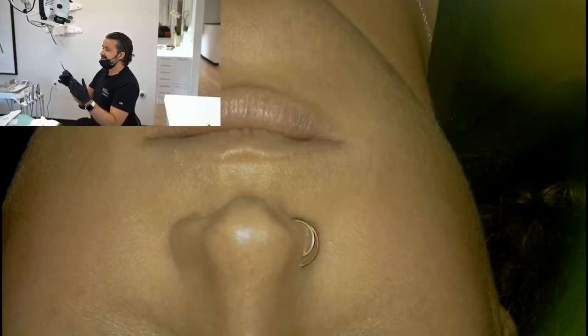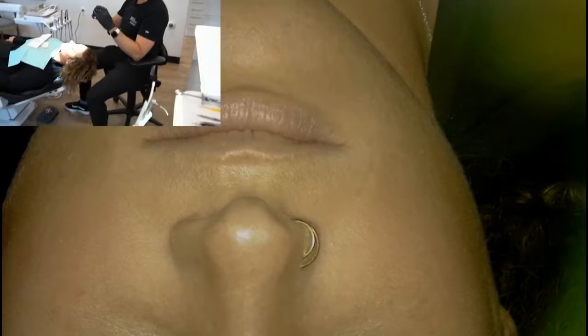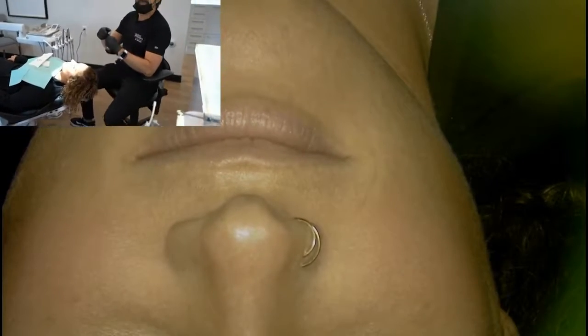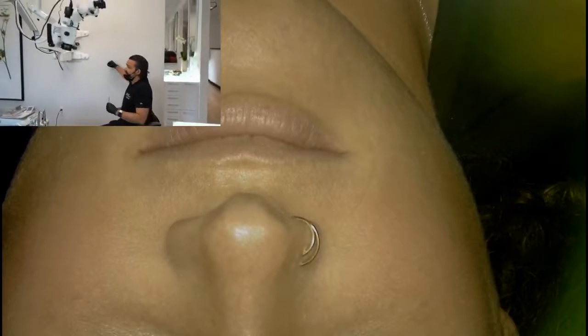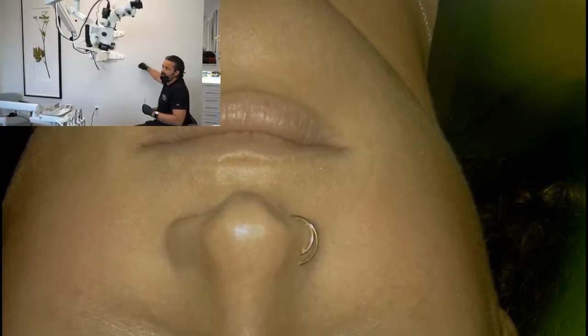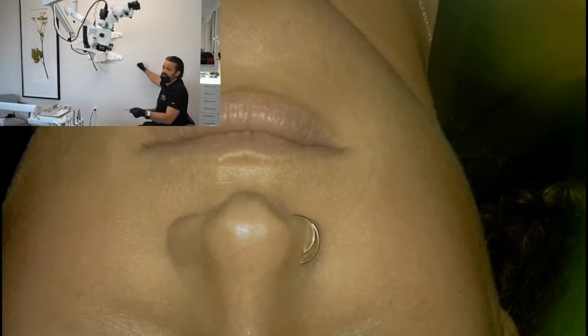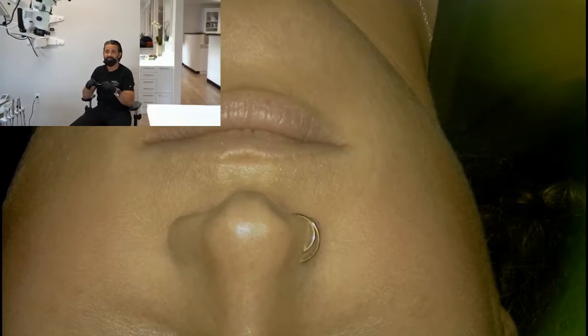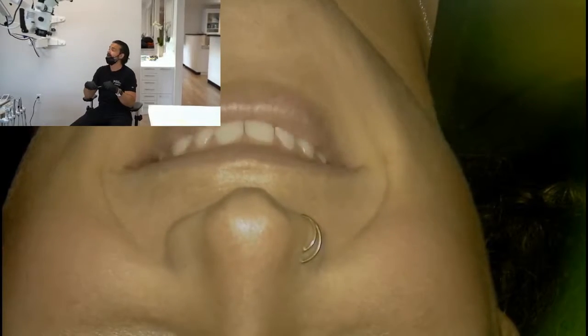The second thing is vibrations. I can tap my feet and that wall's not vibrating that image. But if someone's tapping or knocking on the wall, you're going to see that come through. And those little details drive you nuts. I mean, we're dentists, for crying out loud. Stuff like that drives us nuts.